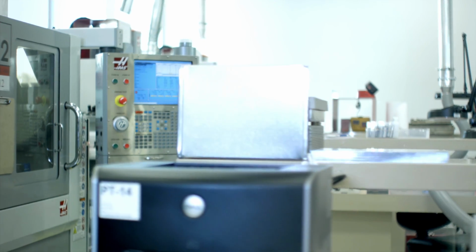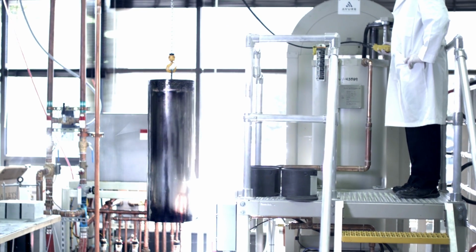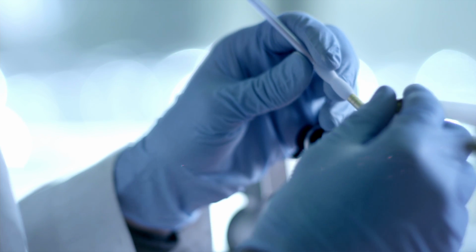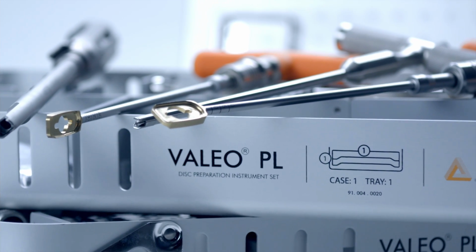Silicon nitride also has the unique distinction of being visible in all types of imaging: X-ray, fluoro, CT, and MRI. Yet it doesn't cause obstruction or leave artifacts like metal. These are huge advantages for post-op implant interface assessment, as well as intraoperative implant placement.